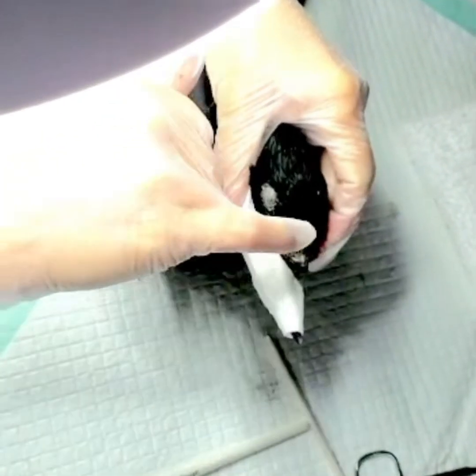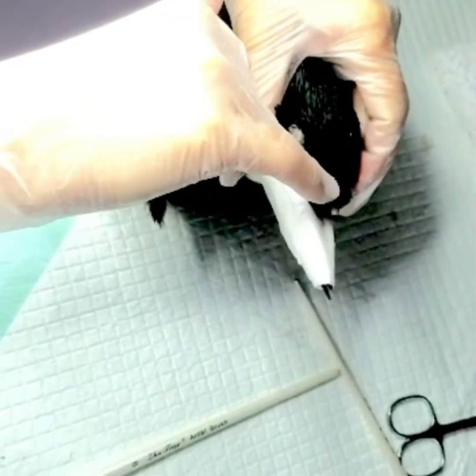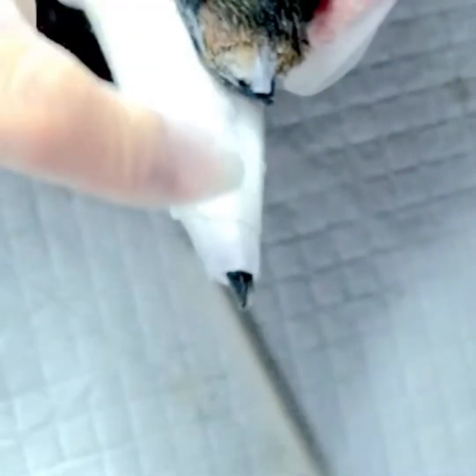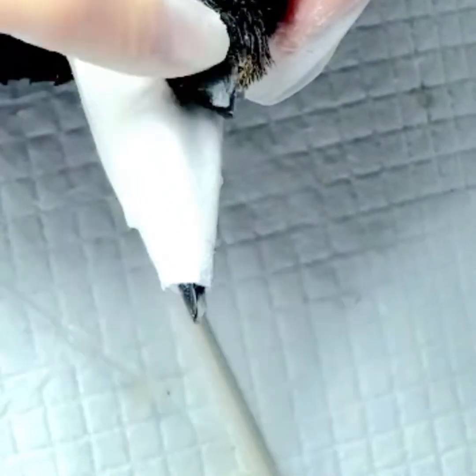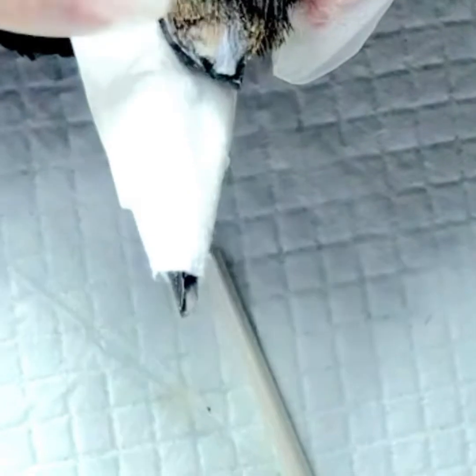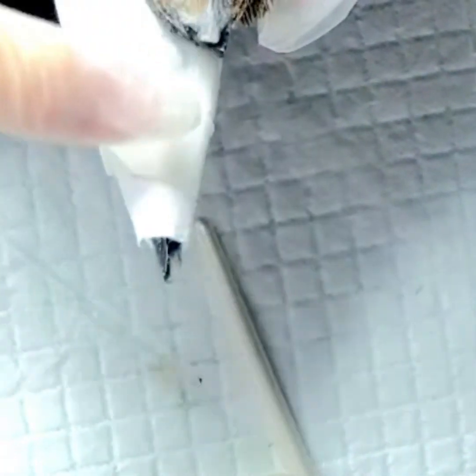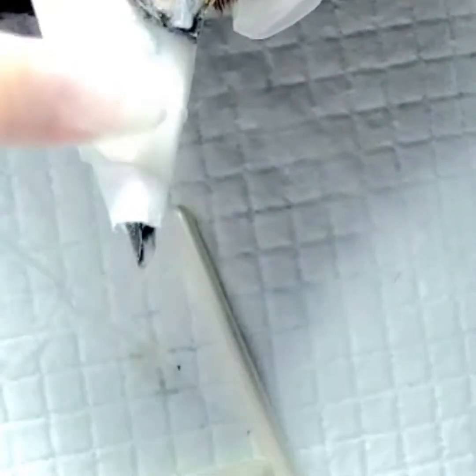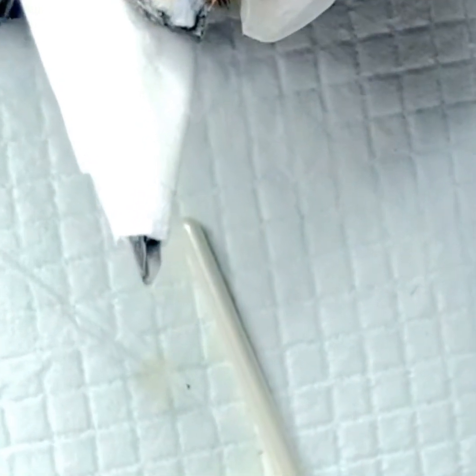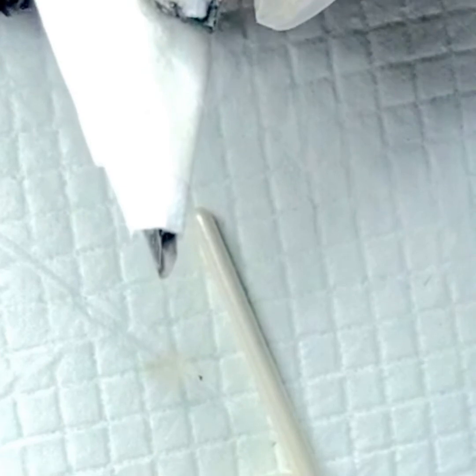Right here in the beak, it's growing upward like a little horn and so that's been taken off because that's not helpful. The acrylic will actually train the beak to grow in the right direction and not go rogue. As it's growing out it will be backfilled and reshaped so that it constantly fits her bite and is aligned perfectly with the lower mandible even as it grows. It will take quite a long time to grow out but she will require regular maintenance every couple of months.